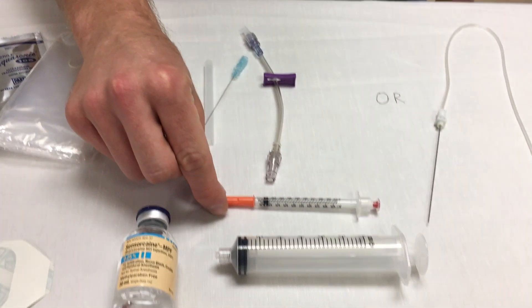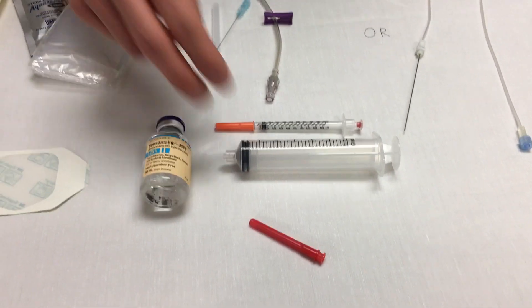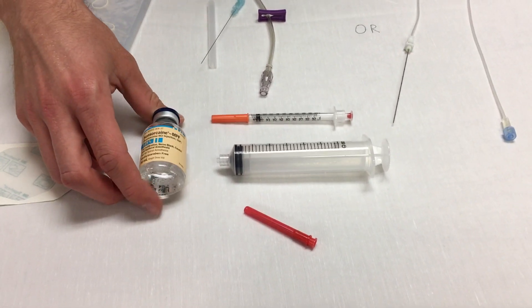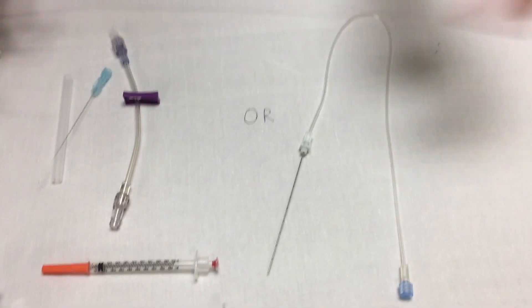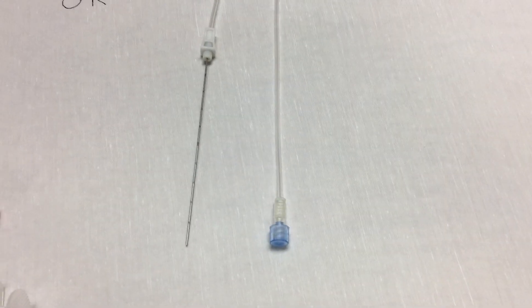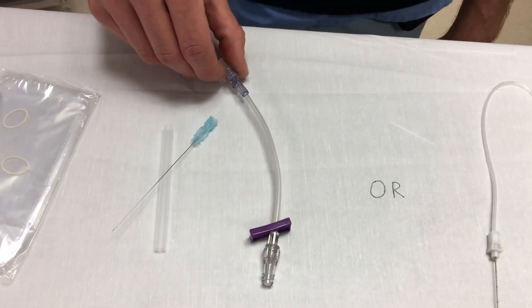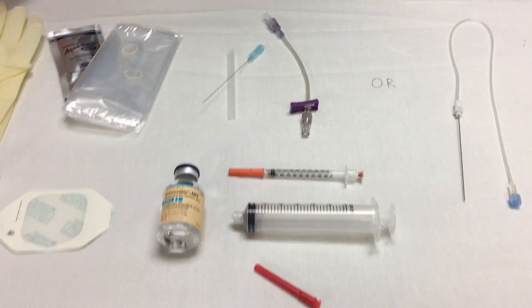You want to have ideally a small syringe or an insulin syringe so that you can anesthetize the skin, and then a 30cc syringe to actually administer the bupivacaine. The third component is you can either have a special dedicated ultrasound-guided nerve block catheter, or a 22 gauge spinal needle with extension tubing through which you can administer the bupivacaine. That's basically the setup — let's get to it.